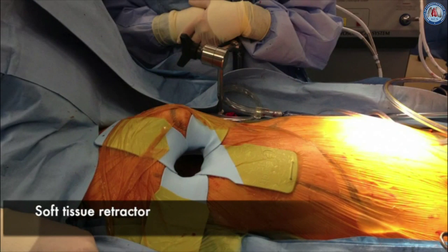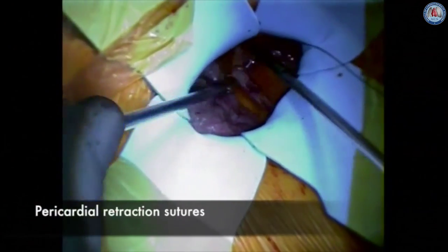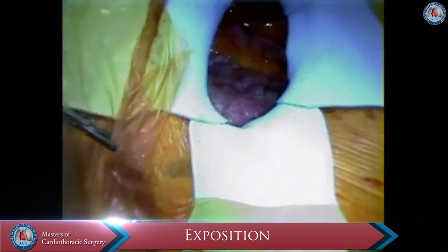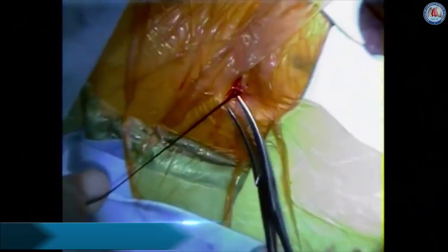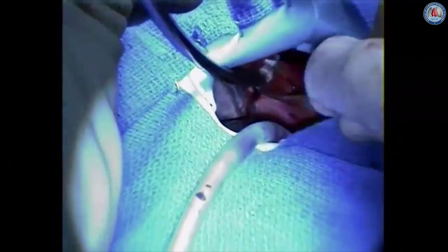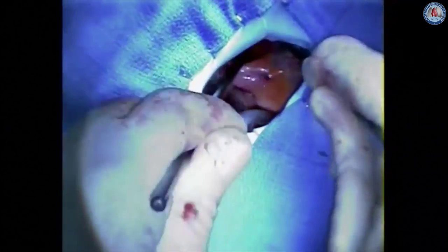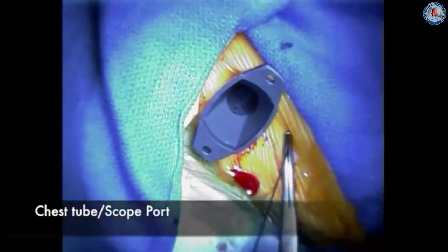A right mini thoracotomy incision is then made in the submammary crease and tunneled up to the fourth intercostal space. The chest is entered through the fourth intercostal space and a soft tissue retractor is used. Care is taken not to do any rib spreading in order to minimize post-operative pain. Pericardial stay sutures are placed in the pericardium and brought out through the lateral chest wall to expose the right atrium and interatrial septum. Dissection of the pericardium is performed up to the ascending aorta and then down to the diaphragm. A port is placed usually in the sixth intercostal space and a camera is used to improve visualization during the case.